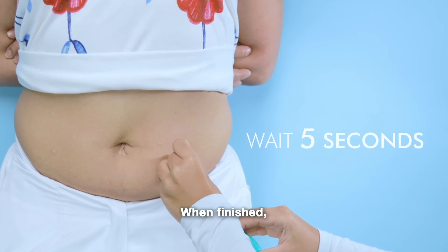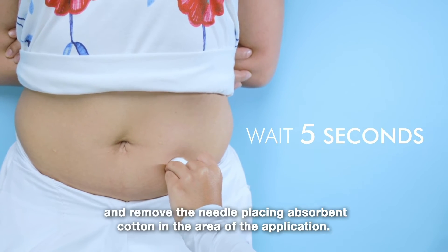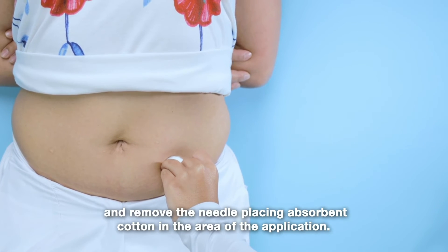When finished, wait five seconds and remove the needle, placing absorbent cotton in the area of application.